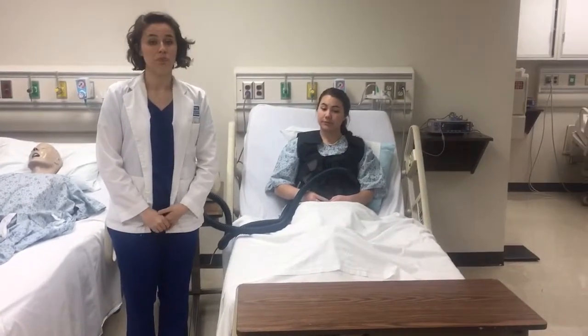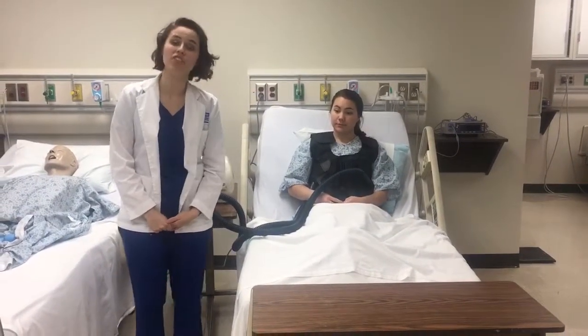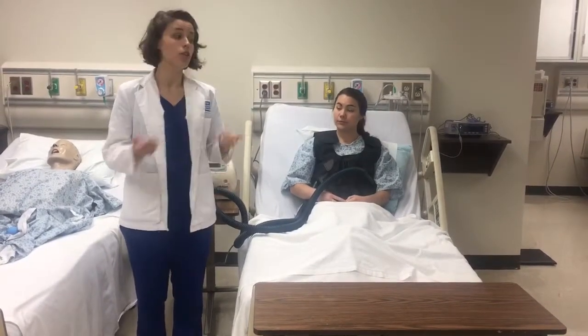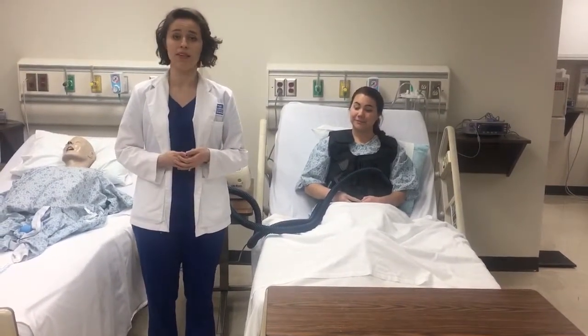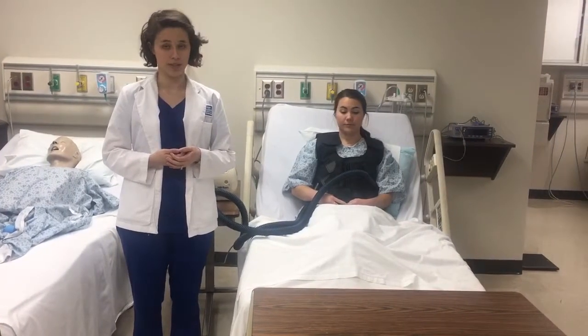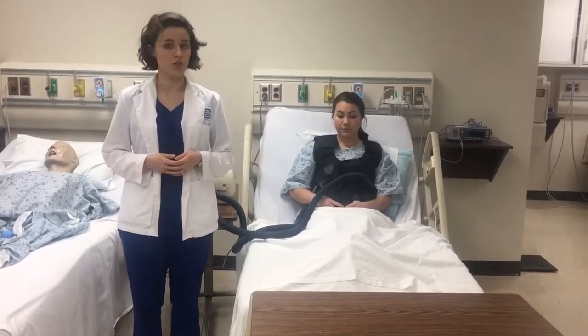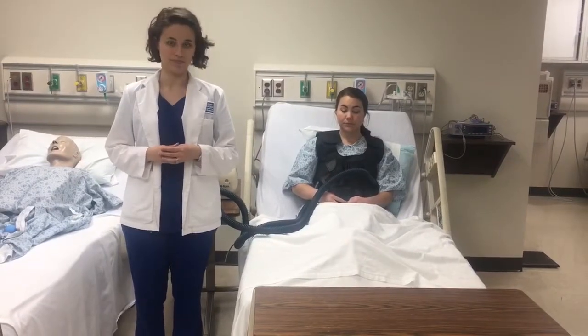There are times when you may need to stop therapy at once. If the patient begins to show signs of hypoxemia during your assessment, during the therapy, if they begin to develop new bronchospasms or wheezing, if they begin to vomit, have new pain, or become acutely hypotensive. If any of these occur, stop therapy immediately, apply oxygen if needed, and notify the nurse and the physician.